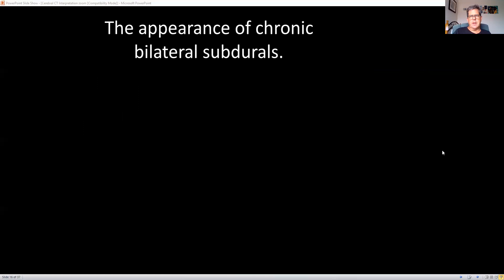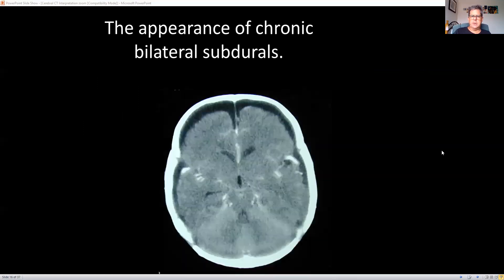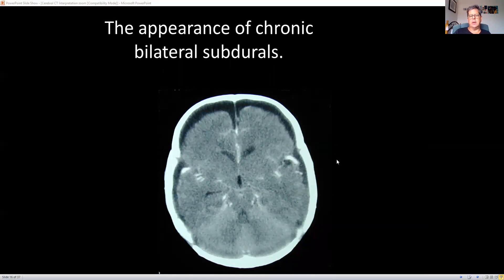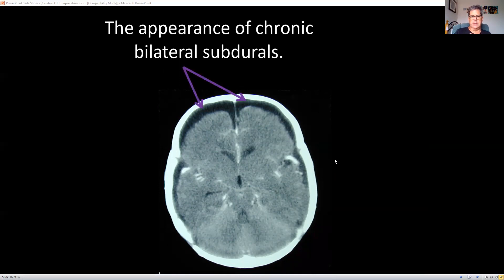With chronic subdurals, they're hypodense. This is an example of chronic subdurals — hypodense on both sides. This is a young brain, a child's brain. This child in fact died from child abuse. Remember that subdurals occur when there's movement between those bridging veins in the subdural space — this happened from shaken baby syndrome. The subdural hematomas shown here are chronic.